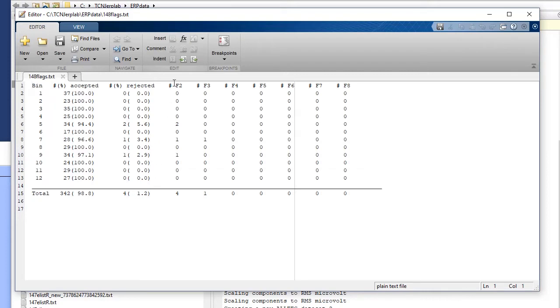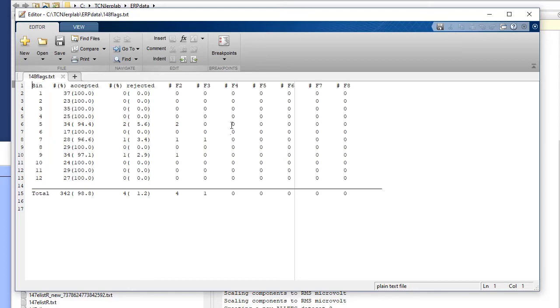You can see F2 houses the number of trials that were rejected for the moving window algorithm. F3 is for the step function and F4 is for the blocking and flatline function. So if you have data where you have a lot of these trials rejected, that means that it was a noisy session.